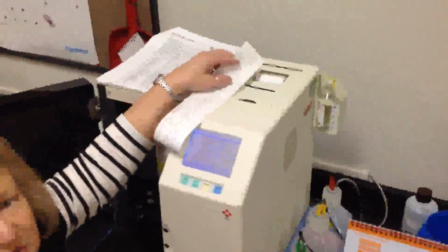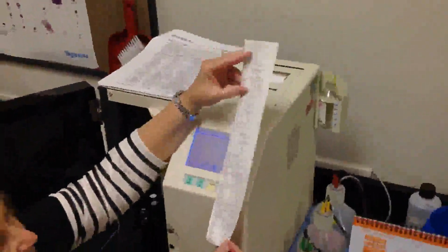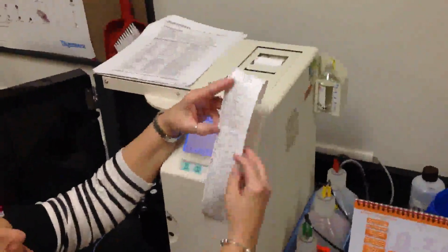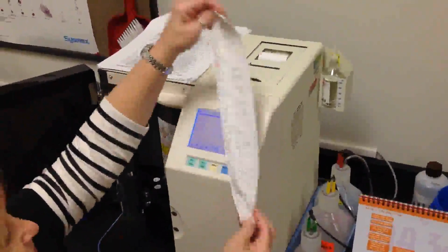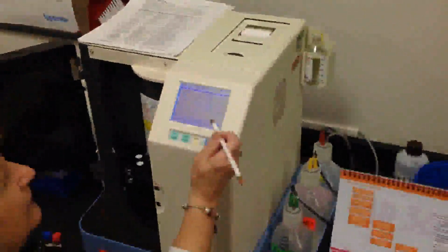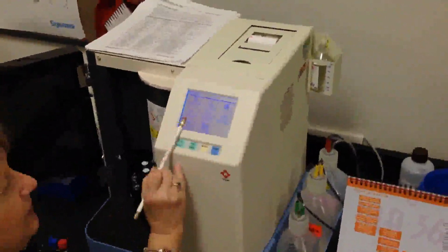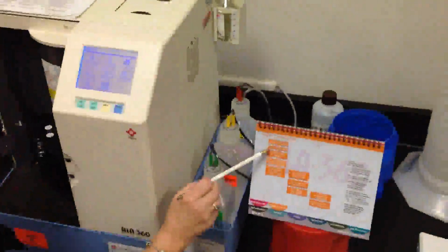After all samples for your calibration are complete, we need to review the data. We have 3 samples for each calibrator. I do not see any error messages. So at this point, I'm going to back out to main menu. I'm going to go to Accept Calibration. Press Calibration Review.